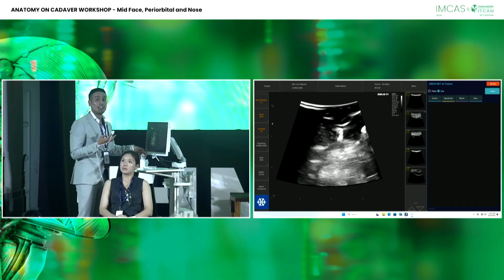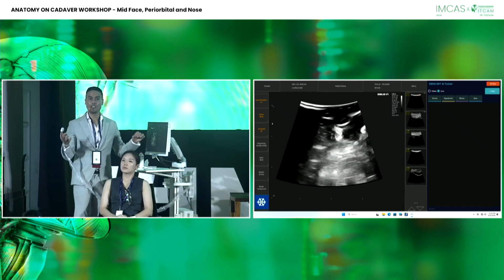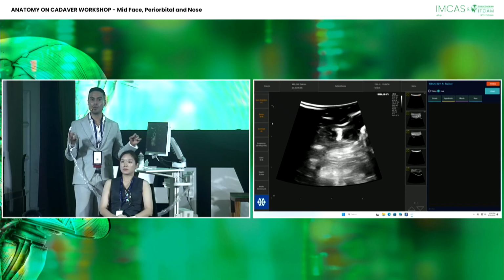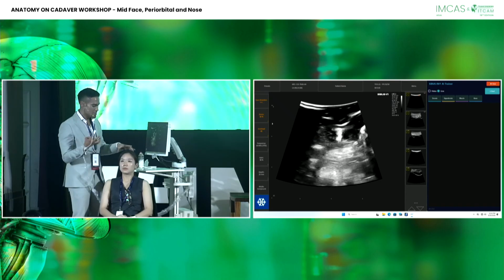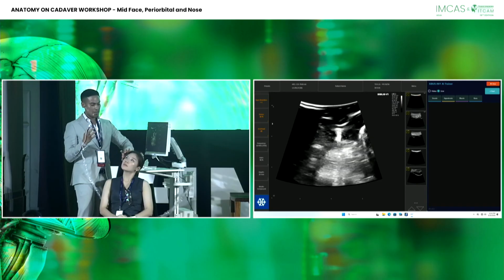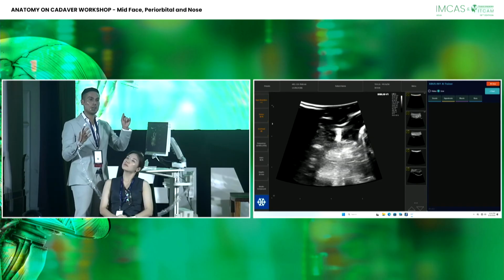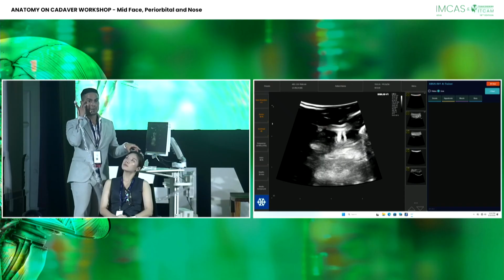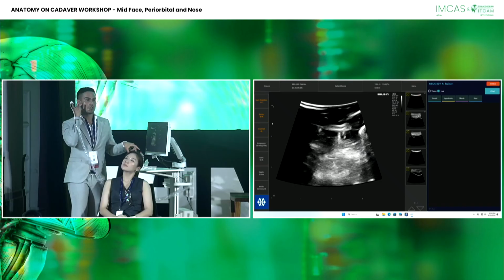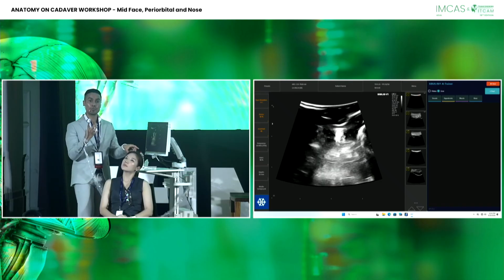When we inject the lateral cheeks, who is injecting here the lateral cheeks? The so famous CK1 point in order to contour the cheeks. All right, good to see. So when you inject material here, you will have the following thing. The filler is going to spread up to the caudal temple and also downwards to the preauricular zone. And I mean with that the deep preauricular fat.